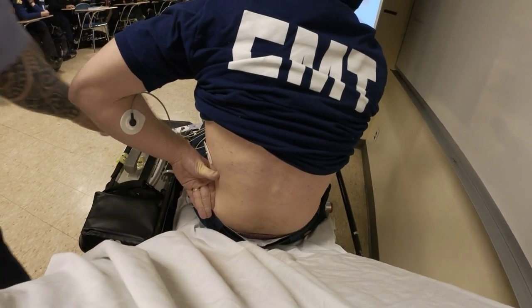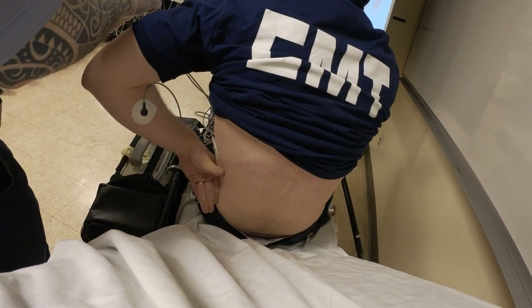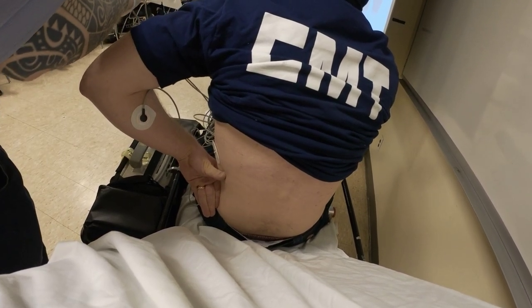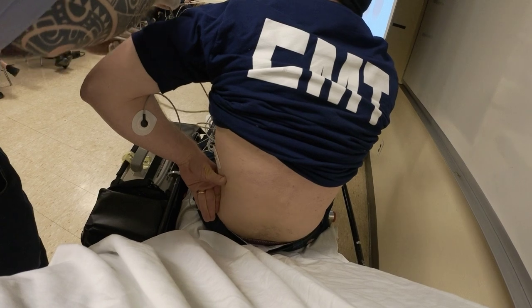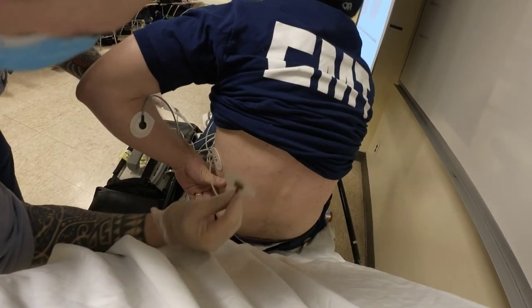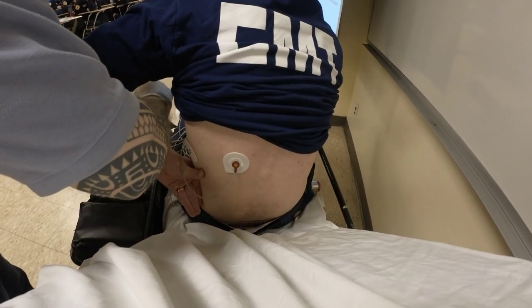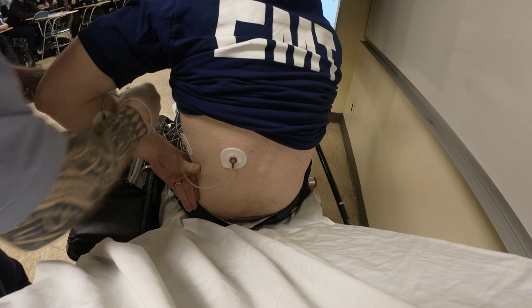And when am I doing the 15 lead? At what conditions? When should I do this? When I believe there is what? Very good.